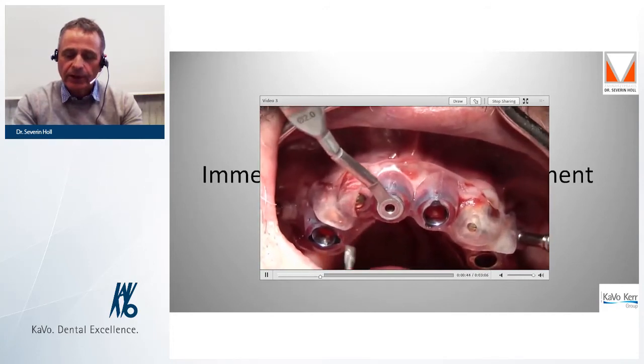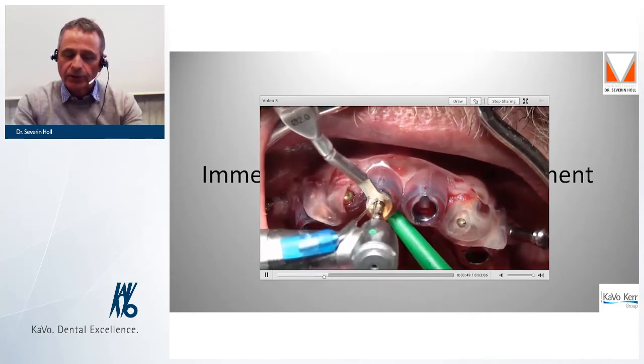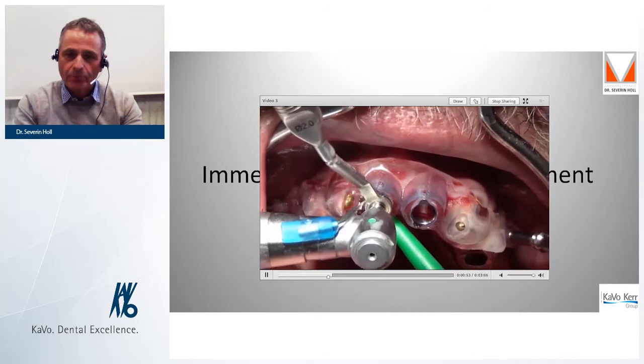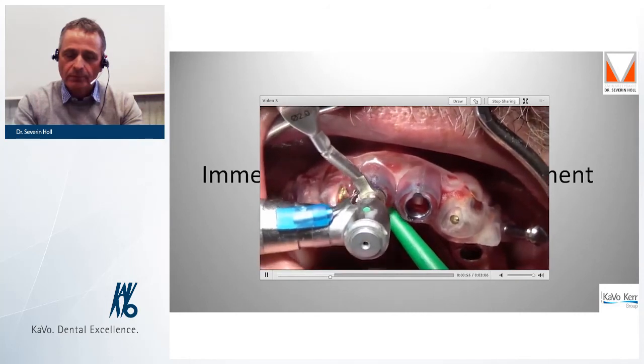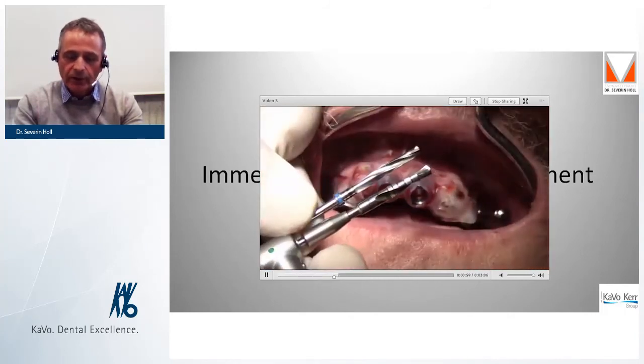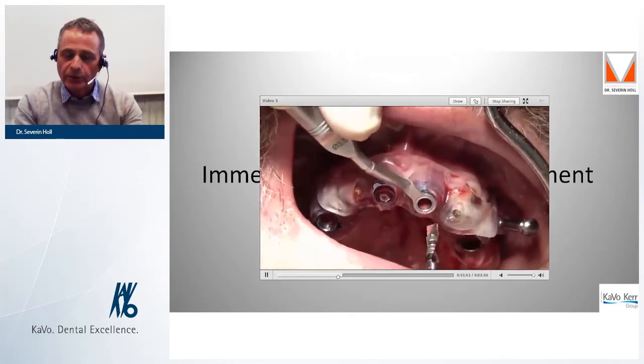reducing the sleeve diameter, and gradual preparation of the implant cavity. Transferring the in-guide drill length to the original drill and final preparation.